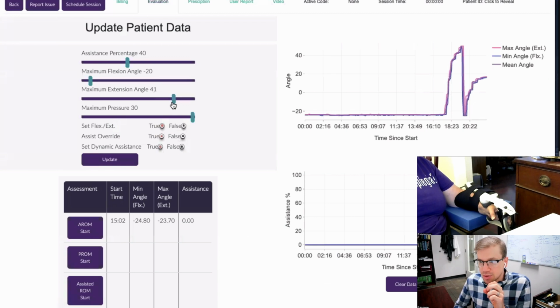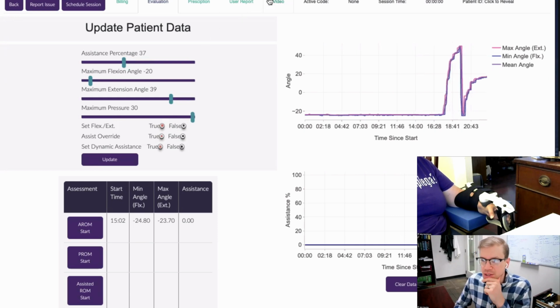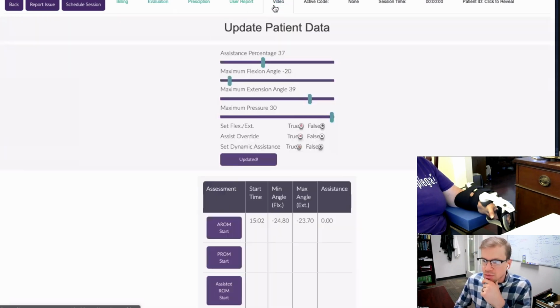So I'm going to do a couple of things. One, I'm going to increase our upper limit into extension. And I'm also going to, surprisingly, reduce the level of assistance a little bit here. And this may help combat some of the fatigue that you're experiencing.